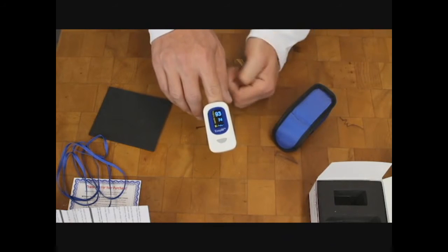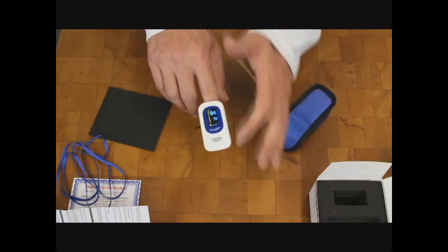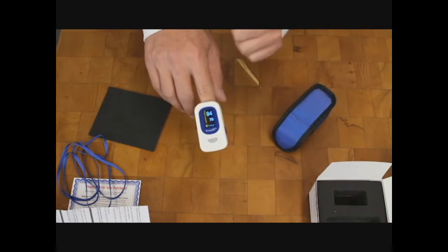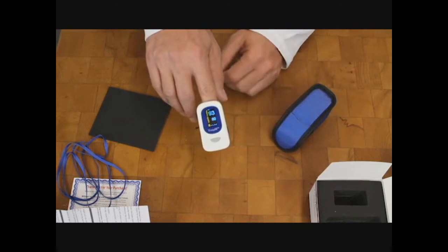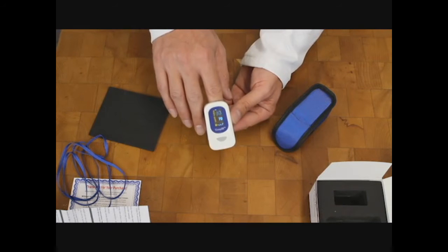Your top number is your oxygen saturation and your bottom one is the pulse. I went through the menu on the back side and turned off the beep because it will beep with the pulse, which is nice if you're monitoring somebody, but it was actually kind of loud for the video so I turned it off.